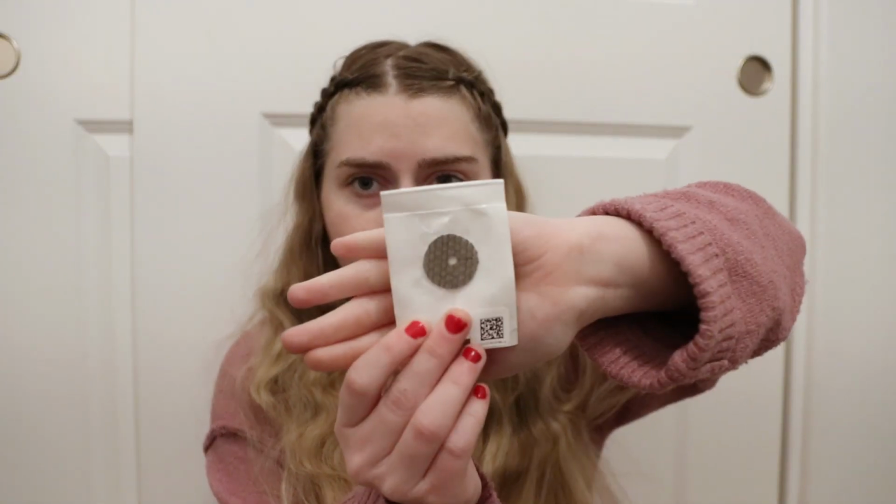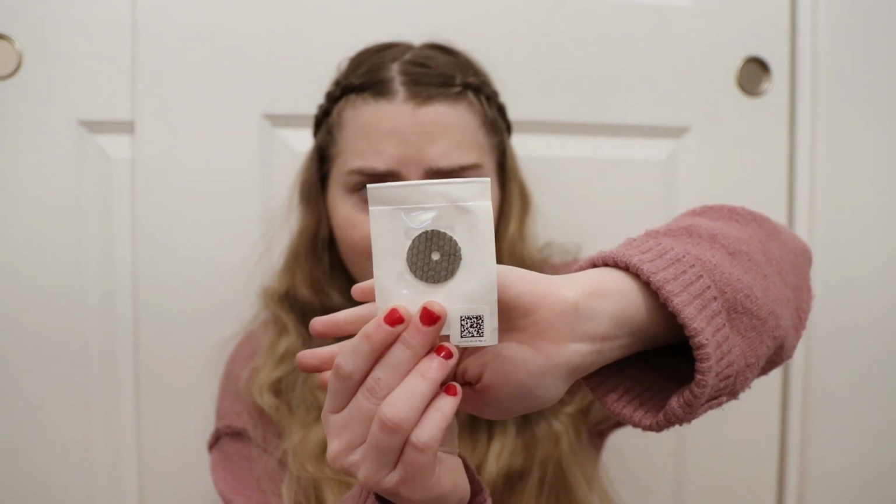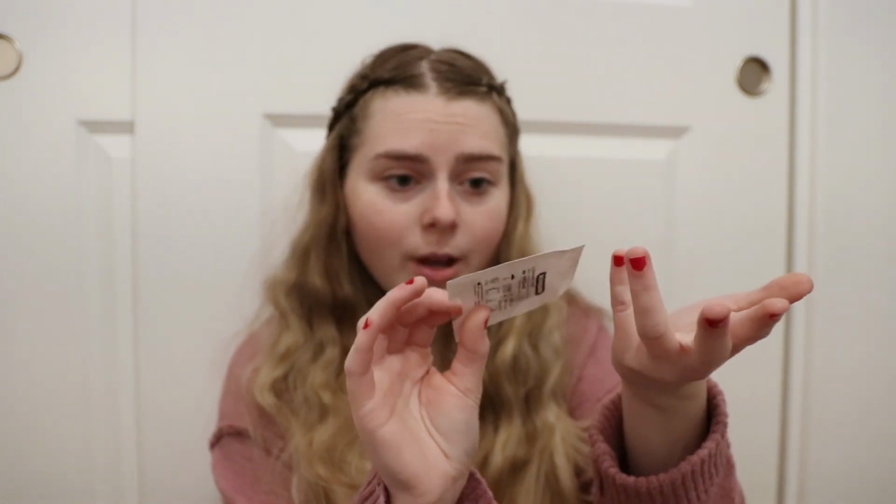Also in here is something called a bio patch, and it's this little disc that goes around your insertion site where the line comes out of the skin. And for me, I'm allergic to that too, because it is soaked in chlorhexidine, so it will make my site really irritated. So in its place, I will use something called a Silverlon, which is made with silver, I guess. I don't quite know.